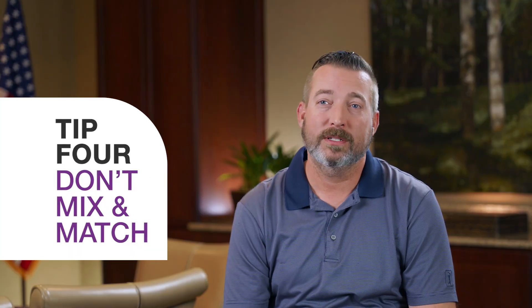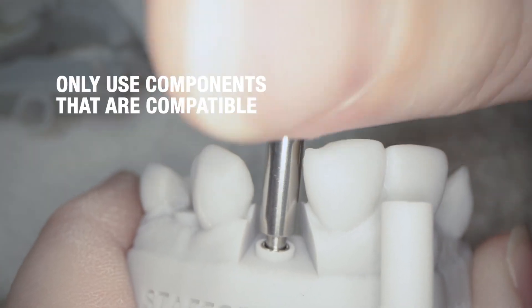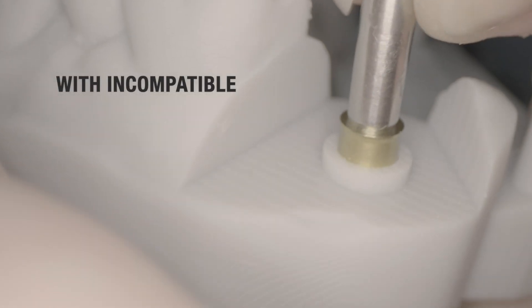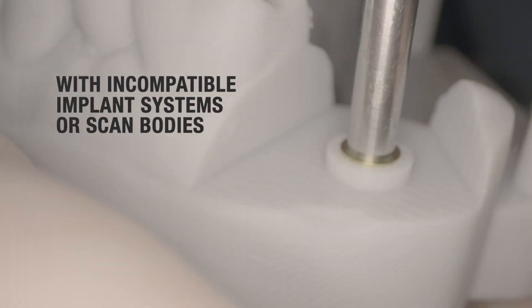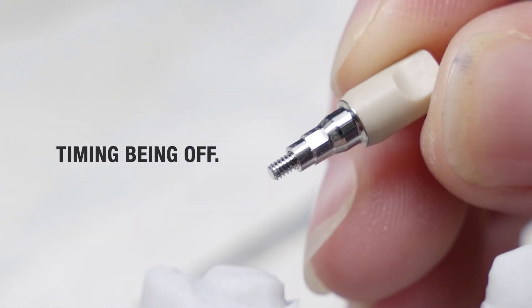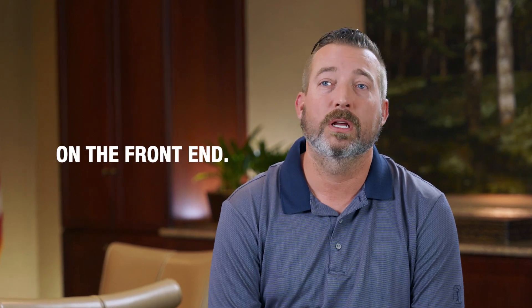Tip number four: don't mix and match. Only use components that are compatible with your implant system. If you try to mix and match too many components with incompatible implant systems or scan bodies, you're going to run into possible misfits, timing being off. It could force a lot of costly errors that we could avoid on the front end.